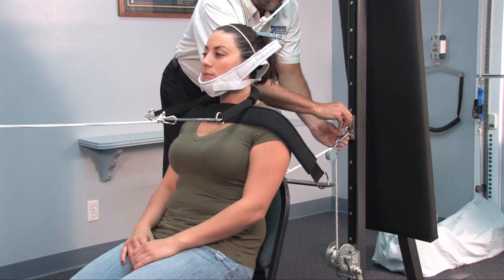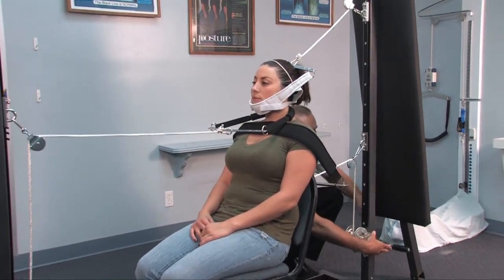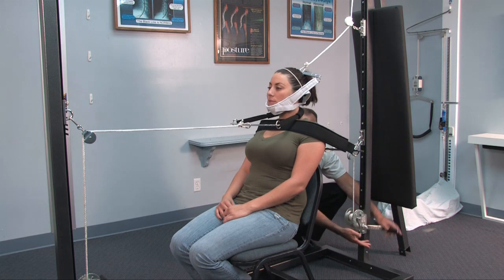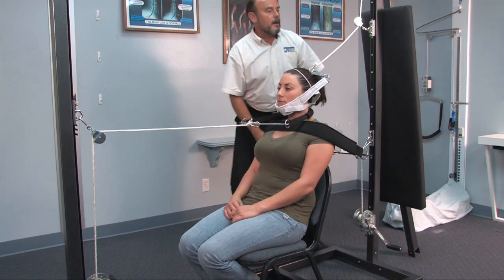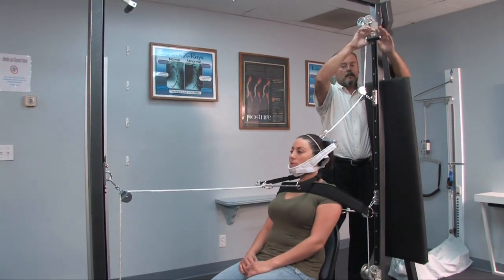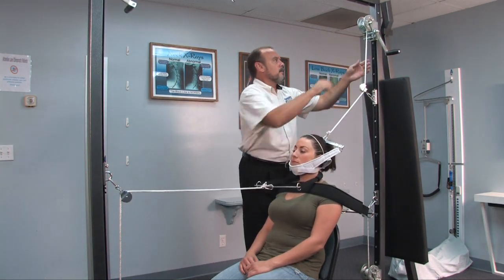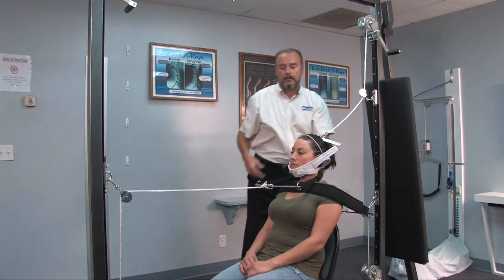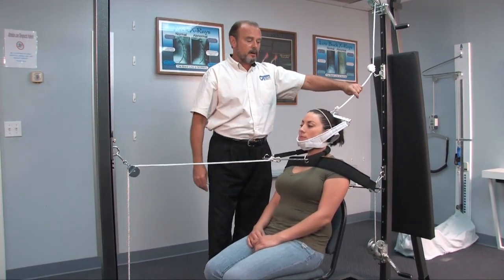We're going to place one strap right across her shoulder joints like that, but there is not a lot of tension on this — it's simply to hold her in place so we don't pull her whole body forward. We're going to try simply to pull her neck and her upper thoracics forward. I'm going to lower that down just like that and tighten that up, then apply a little tension to the back. The main thing we want is to pull the neck forward, so the main pull comes from the front pull. There should be twice as much front pull as there is back pull.